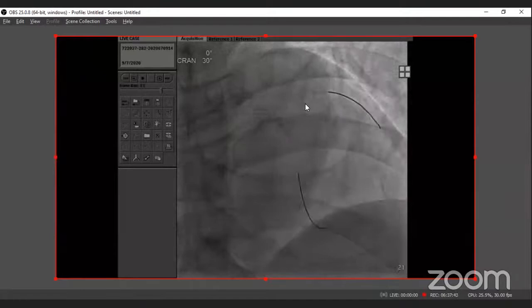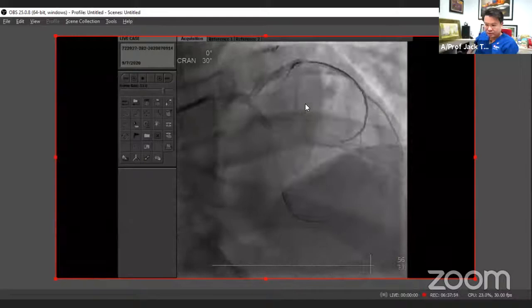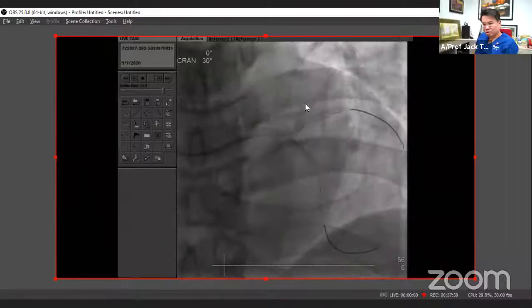Do you have the angio to show us? Yes, we have one for that. We just look at the angio before the IVUS, please. Yeah, so this is the angio. As usual, the angio looks fantastic, Aaron. Looks very nice. So play the IVUS from the LAD to the left main.